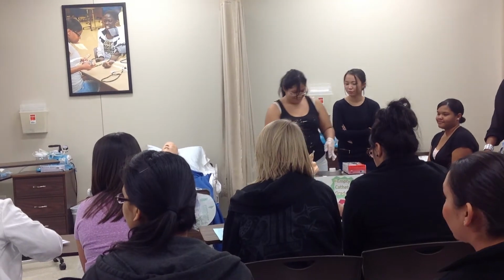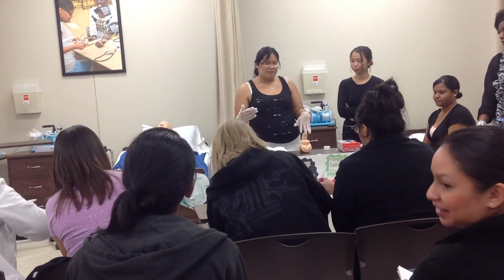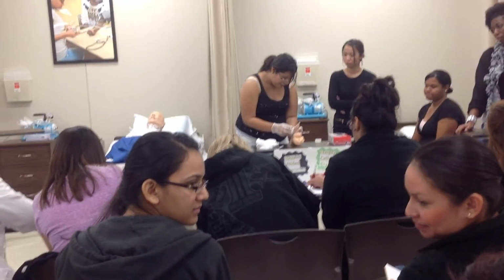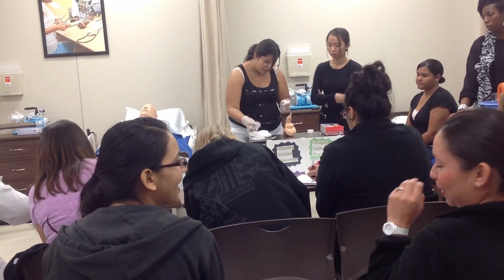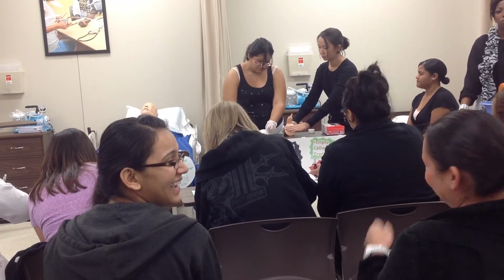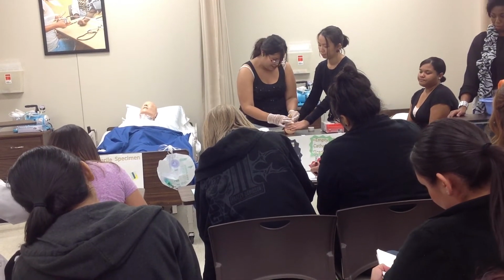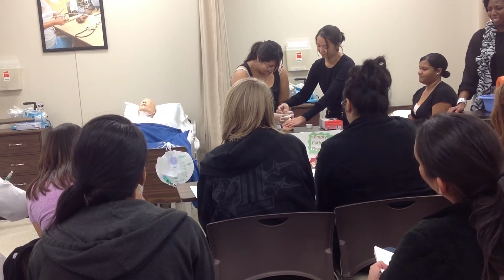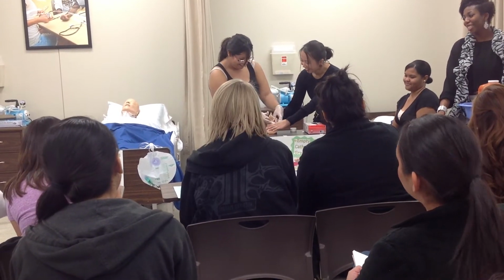After a while, usually the patient will take it off. So you're going to want to be replacing this every 8 hours, so you're going to have to be rinsing it. And then you're just going to roll it off nice and gently. You might want to put some adhesive remover. Just be a little more gentle there.